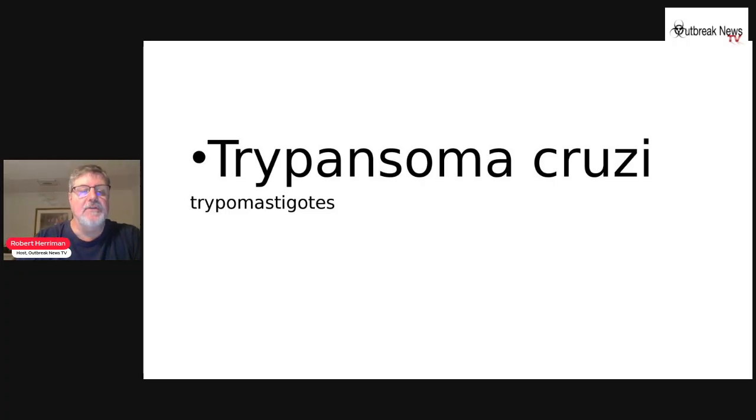That's one of the key characteristics. And also location, right? Trypanosoma cruzi would be more likely Latin America, while Trypanosoma brucei will be strictly parts of Africa.